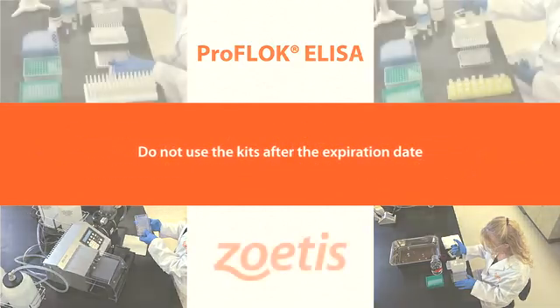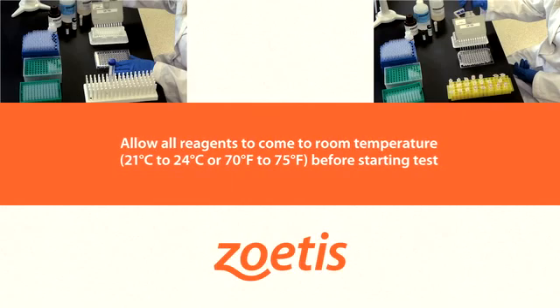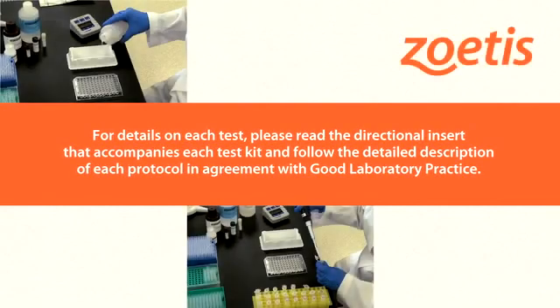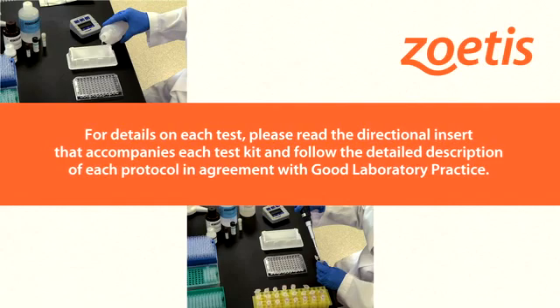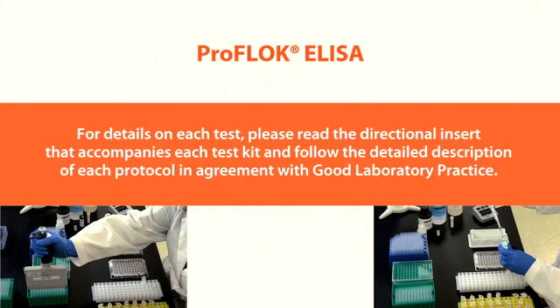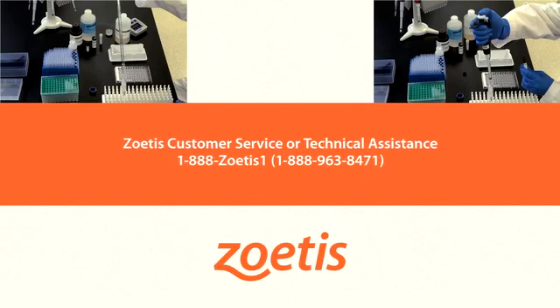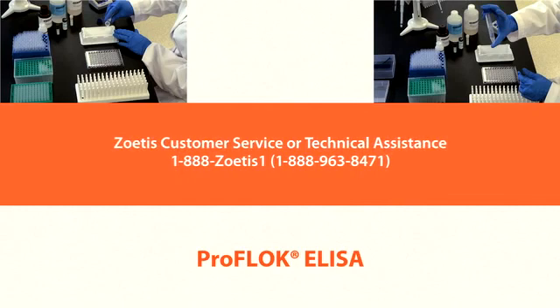Do not use the kits after the expiration date. Never pipette by mouth. Allow all reagents to come to room temperature, 21 to 24 degrees Celsius or 70 to 75 degrees Fahrenheit, before starting each test. Remember, this video provides a general overview of the procedure for performing ProFlock ELISA tests, but there are slight variations across the different test kits. For details, read the directional insert and follow each protocol in agreement with good laboratory practices. For assistance, contact Zoetis at 1-888-963-8471. Thank you.